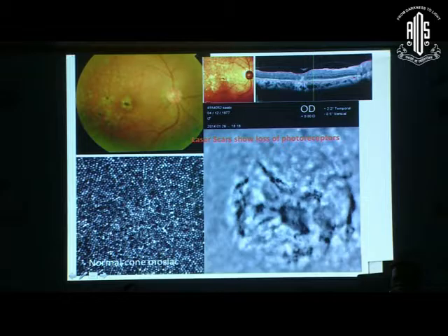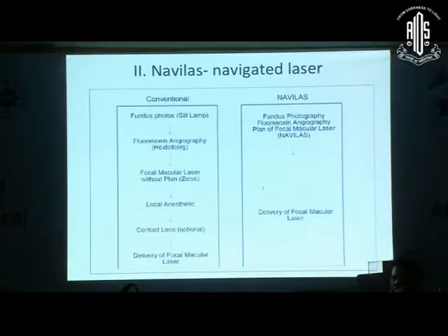And this is what normal adaptive optics would show. This shows a beautiful rod and cone mosaic. And this is what we have achieved with this scar. So we have totally knocked off the photoreceptors in the center because of whatever reasons, because we had an inadvertent burn in the fovea. And when the macula is edematous, we sometimes tend to go high on the power and we may permanently cause the damage. So that is what is against the normal laser.